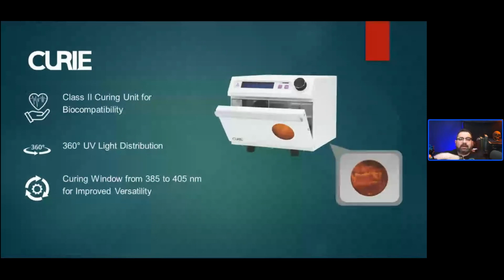So let's say, for example, I'm doing a base plate or a custom tray. For that resin, I'm going to be using Dentona tray. Once I've printed everything and dried everything, I need to cure it in there. So I'll put it in that box, choose from the menu the resin that I'm using, just press the button, and it goes through the whole process.